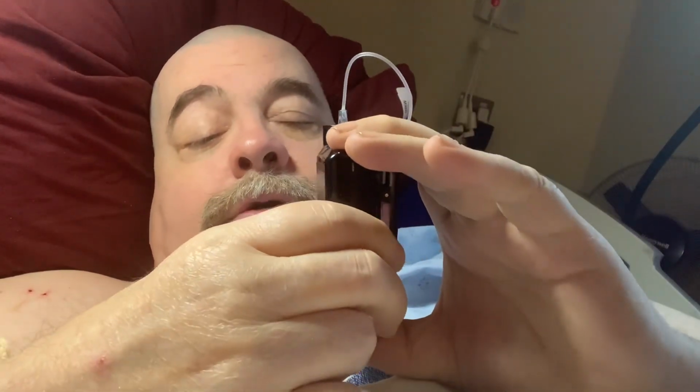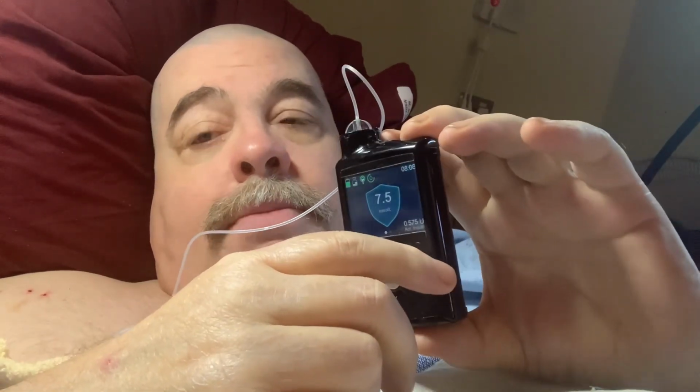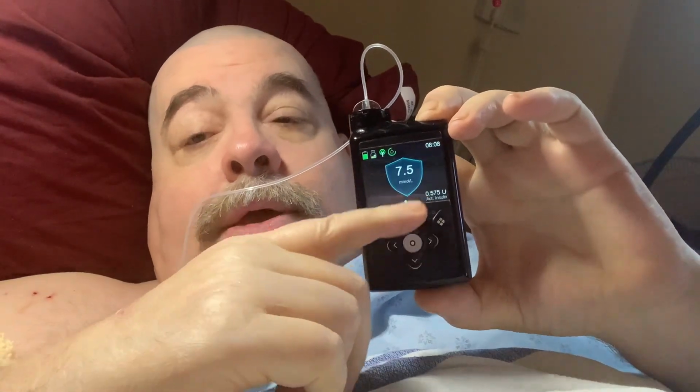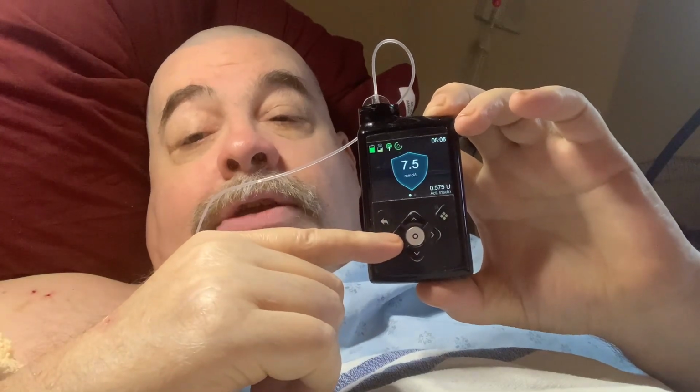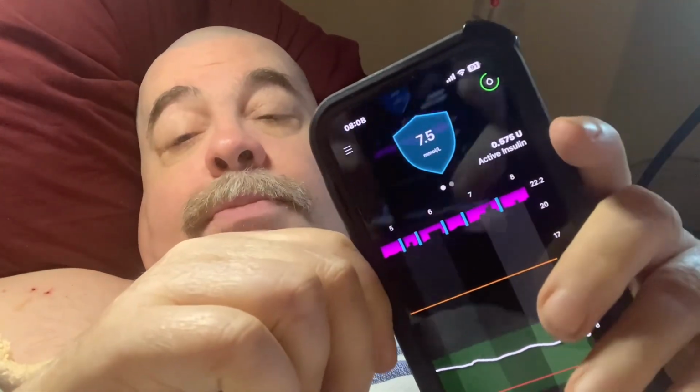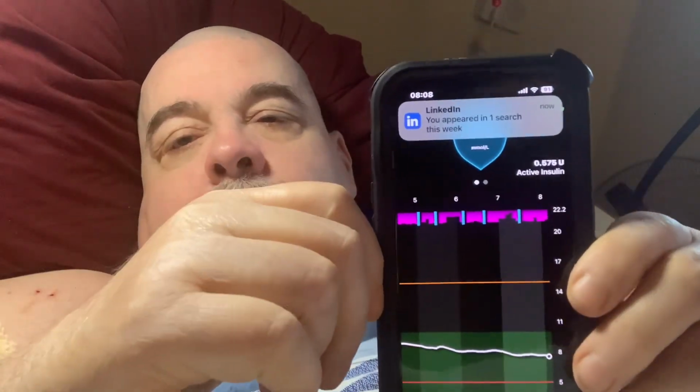you have to get used to two lines on your pump. Now, I show this as the pump and what your pump screen on the Medtronic 780G pump will look like. It's virtually the same as here. So this shows it a bit better and a bit larger. So here we go.